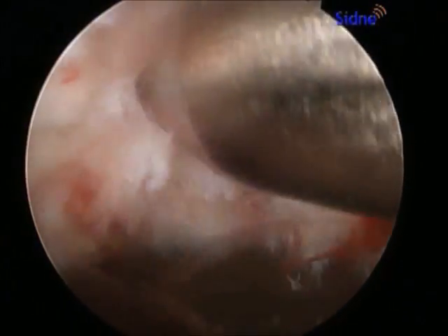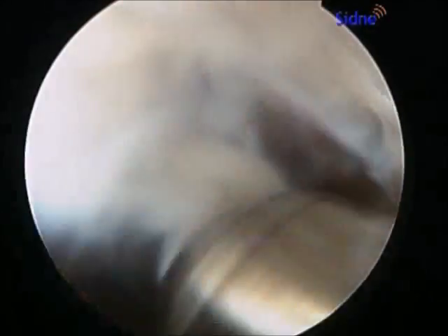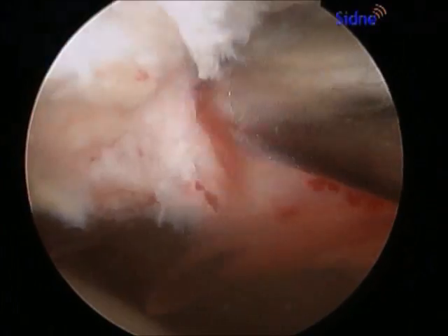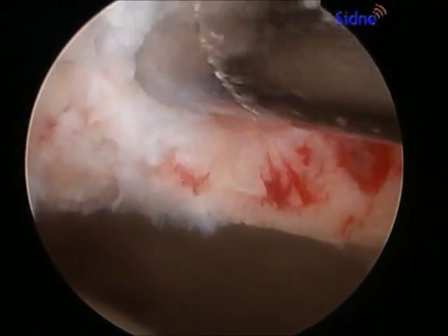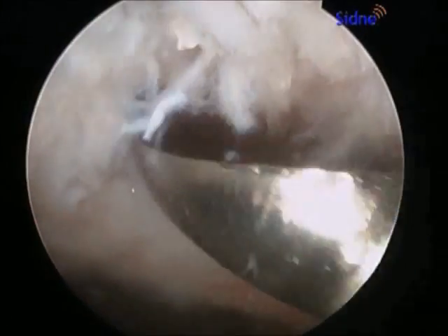A blunt probe is used to find a soft area of the bone structure of the anterior acetabulum or socket. A shaver is introduced to clean soft tissue in this area and help open the cystic area. This cyst had been identified with an MRI scan.